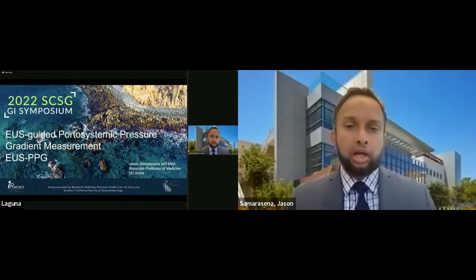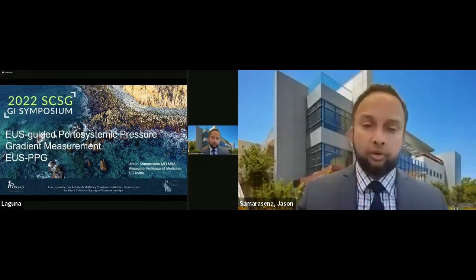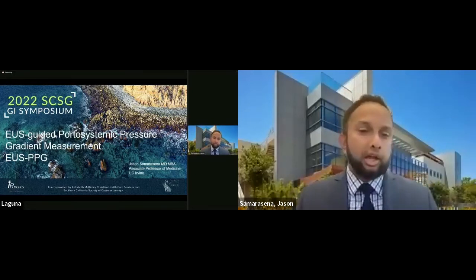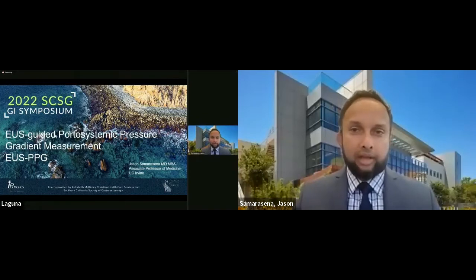EUS-guided portal systemic pressure gradient measurement is really my topic for today. In the next 20 minutes, I'll hopefully give you a little flavor of the history of how this was developed, and I'm proud to say that a lot of this technology was developed here at UC Irvine, and where we are along this journey. These are my disclosures.